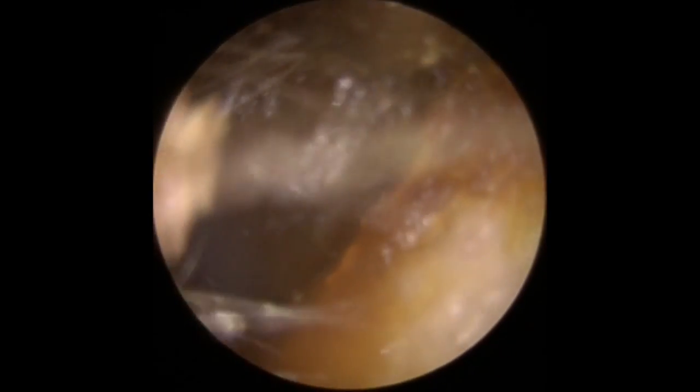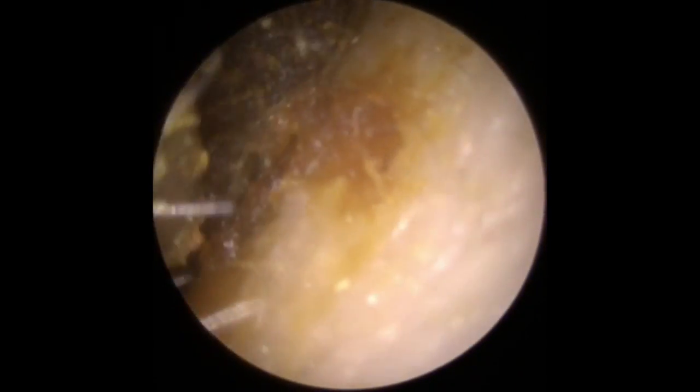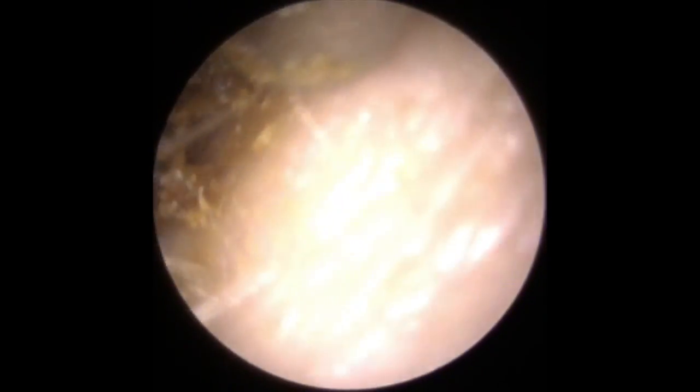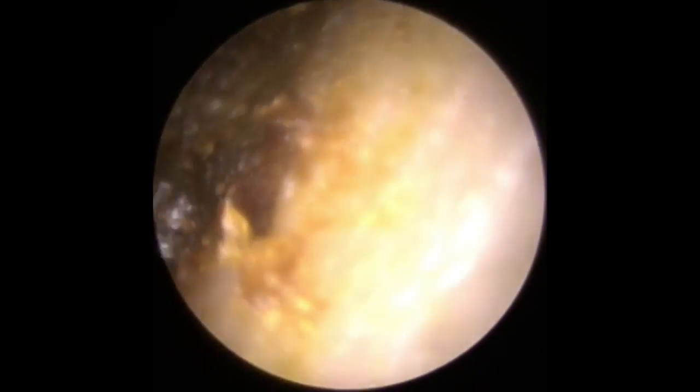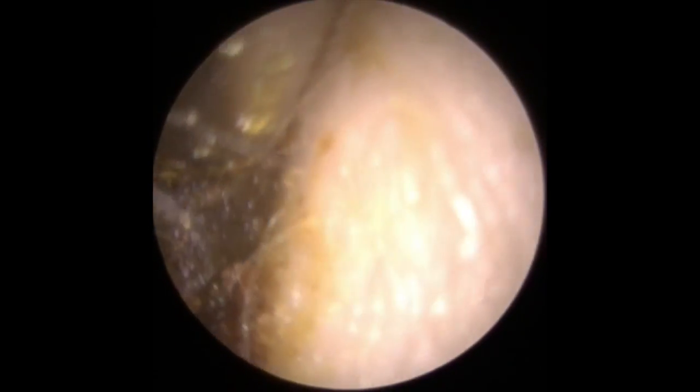You do sometimes get patients that throw you a bit of a curveball — you look in and you think, oh yeah, that's one particular type of wax, and it might look quite soft but it is solid as a rock. But most of the time you can usually get a good judge of what the wax is going to be like. So we can see here, because the wax has got that slightly stickier nature to it, and because the entrance to the canal is quite narrow, the wax is stuck in the entrance to the canal — stuck to both canal walls. So I'm just trying to manoeuvre this out. If it doesn't look like it's going to budge with suction, what we would normally do is go in with a Jobson horn just to get behind it and flick it out. But it's managing to break itself down, so rather than switch tools now I think we're just going to carry on with the suction on this side.